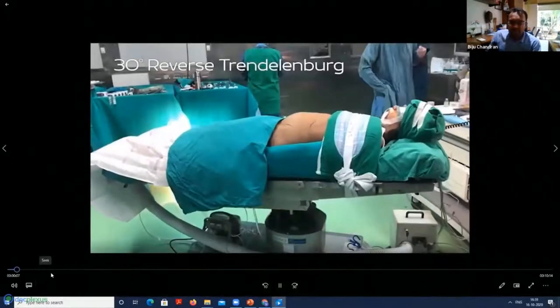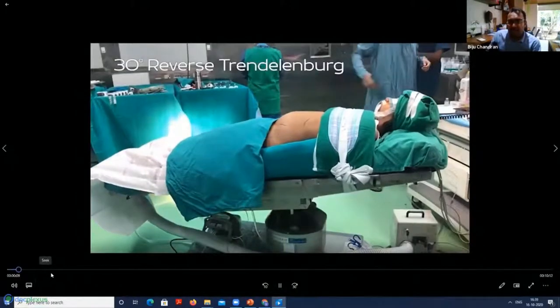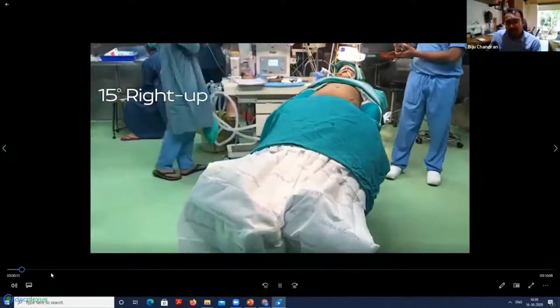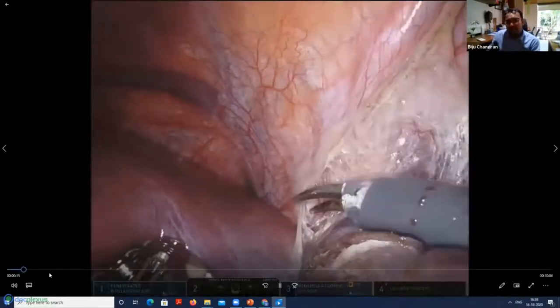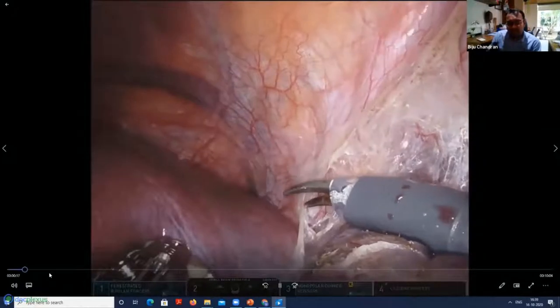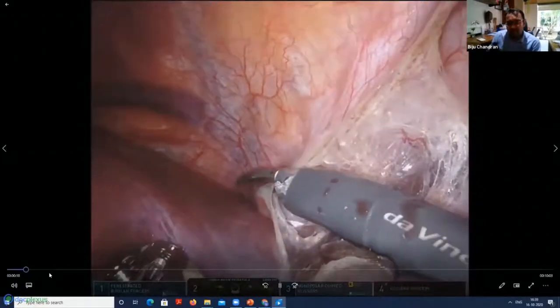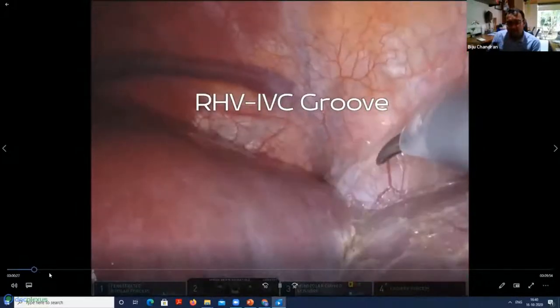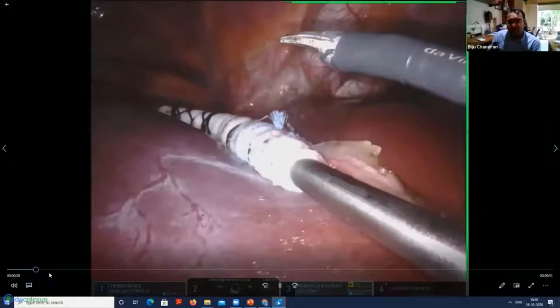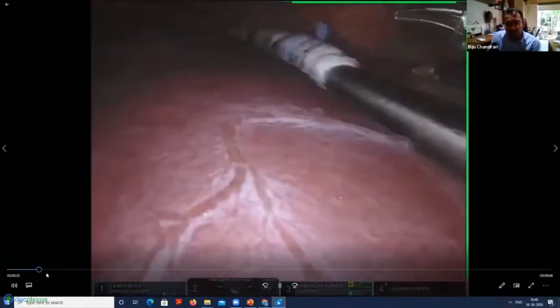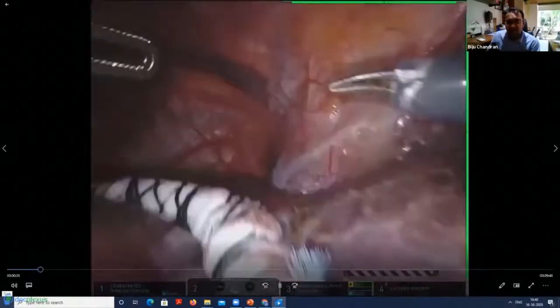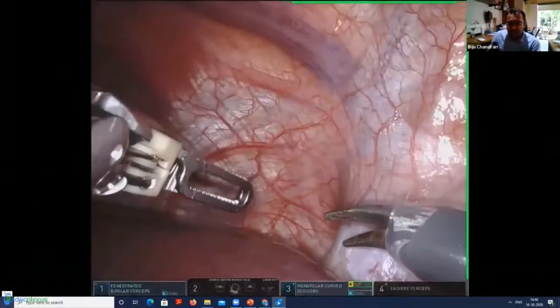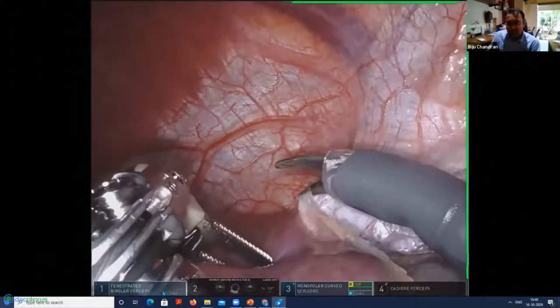To start with, this is how we position the patient: 30-degree reverse Trendelenburg and 10 degrees right side up. Straight away, after taking off the falciform ligament, we come to the groove of the right hepatic vein and the IVC. We mark the groove of the right hepatic vein and IVC initially so we don't have to return there later. It's quite important to dissect onto the right side of the right hepatic vein, lifting the peritoneal layer gently to avoid injury.